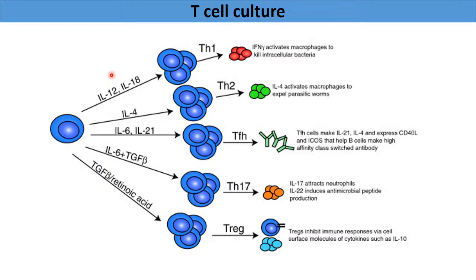Cell culture training means getting trained in the real conversion, real maintenance according to their natural environment, according to their niche, learning their requirements, fulfilling those requirements, understanding the health of cells by microscopy, understanding the quality and purity of cells by flow cytometry, purifying them, and isolating them with the help of magnetic cell sorting or flow cytometry based cell sorting. These are the parts of what? Cell culture.